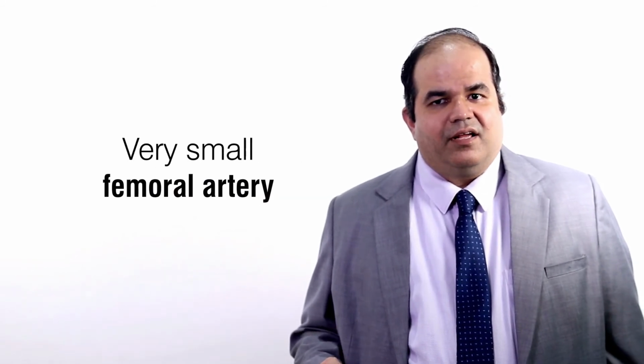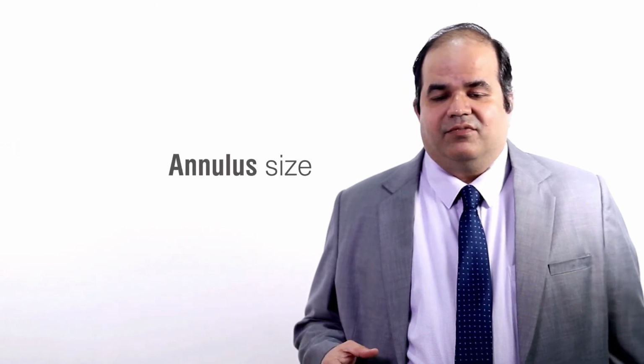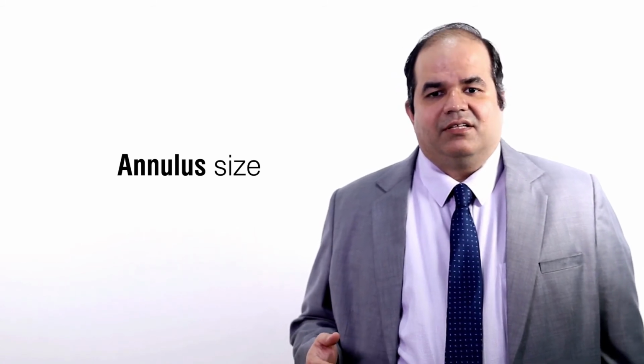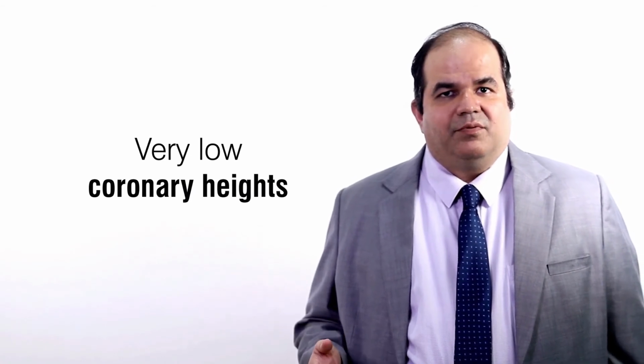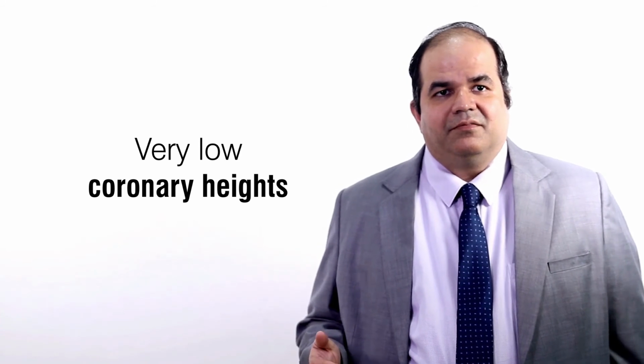Having said that, we also need to consider many other factors which are not considered in risk scores, like anatomical factors. For TAVR, for example, a very small femoral artery or access related issue, or an annulus size which is out of the sizes available for the valve, or the chances of very low coronary heights with bicuspid aortic valves. These are the cases in which surgery would probably be better.